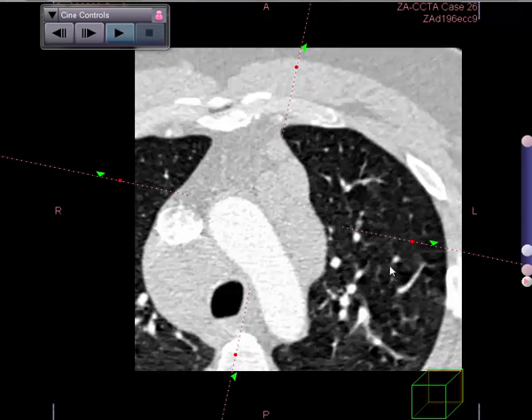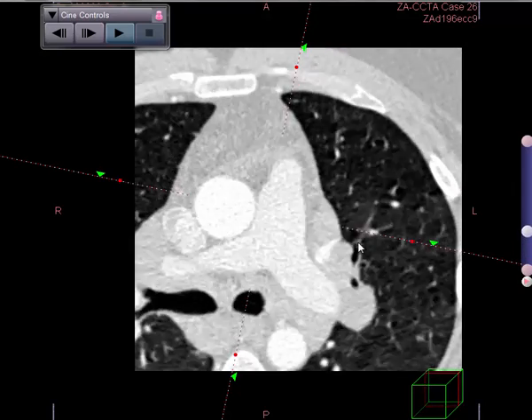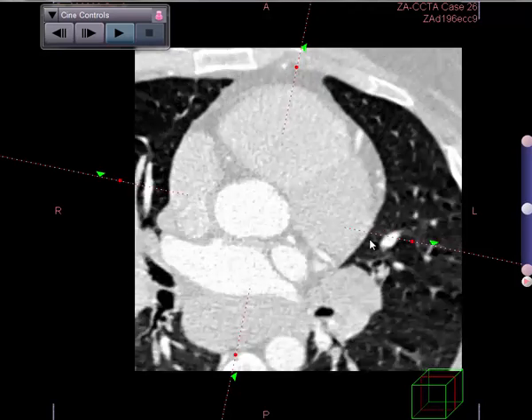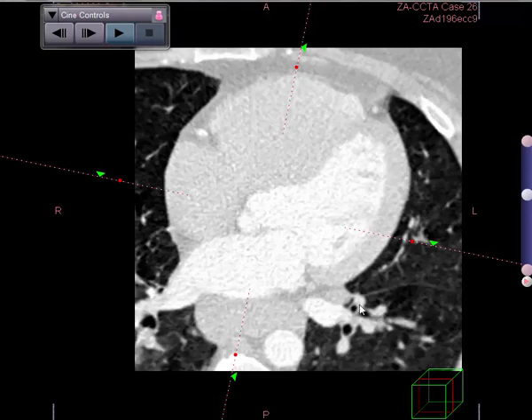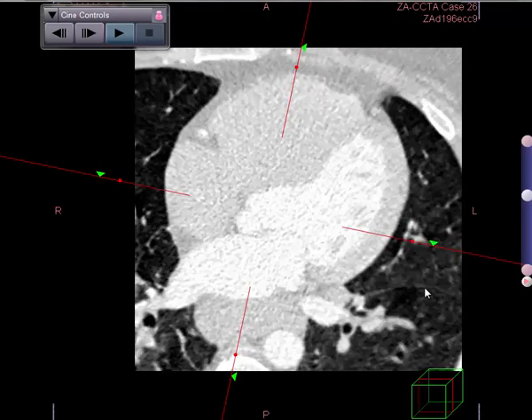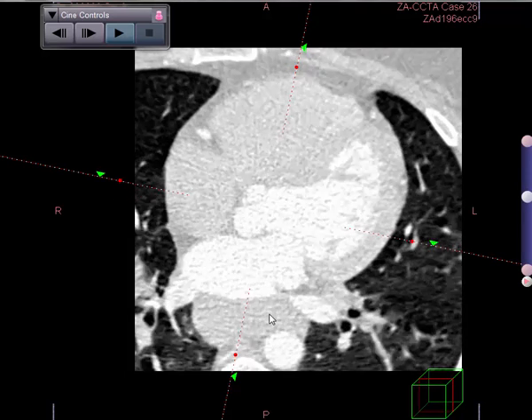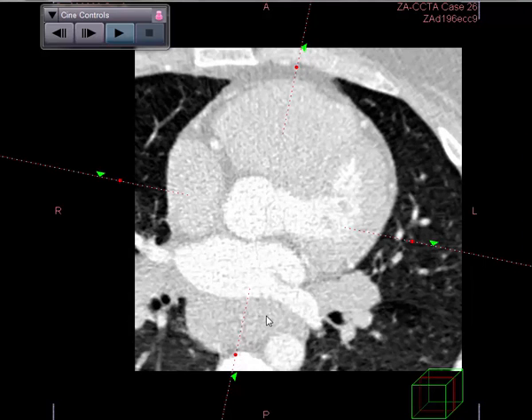This person likely has a lymphoma — Hodgkin's or non-Hodgkin's. Difficult to separate out, but this is likely the cause of the progressive shortness of breath. There are clearly some changes in the lungs as well, but coronary disease is not this individual's problem. You need to be very careful in looking at the remainder of the cardiac field of view because there is clearly a solid anterior mediastinal mass here.